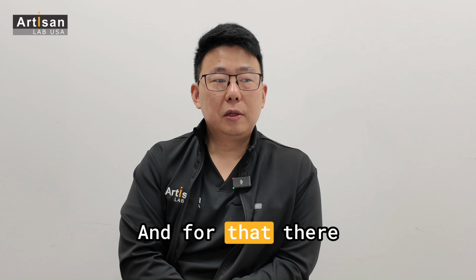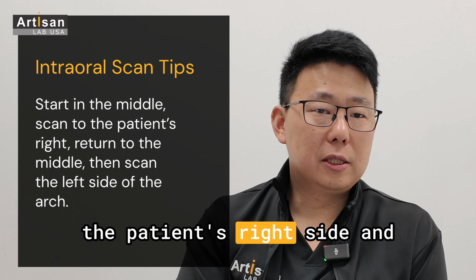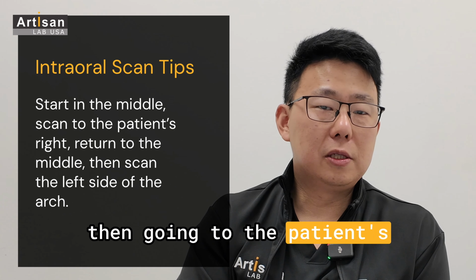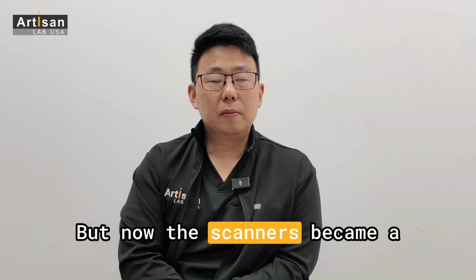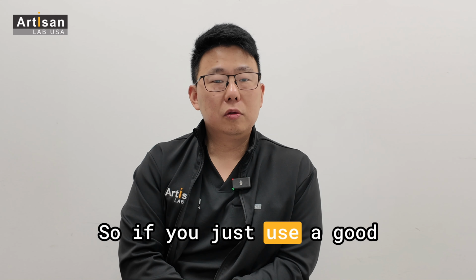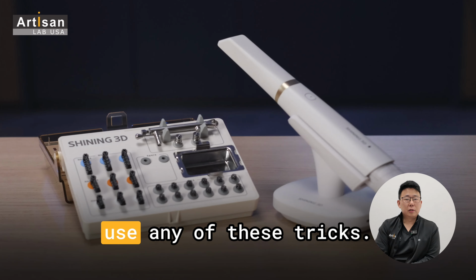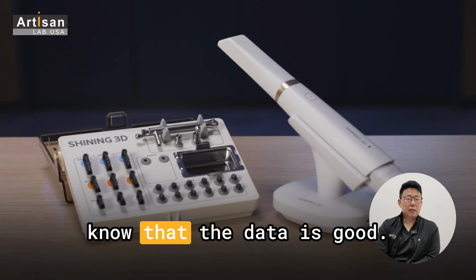For that, there are some tips, such as starting from the middle area, then going to the patient's right side, coming back to the middle, and then going to the patient's left side of the arch. But now the scanners have become a lot better compared to before. So if you just use a good scanner like Shining 3D, then you don't have to use any of these tricks. You can just scan and you will know that the data is good.